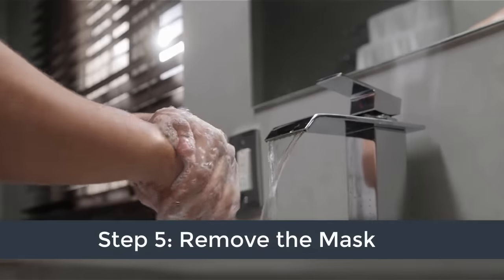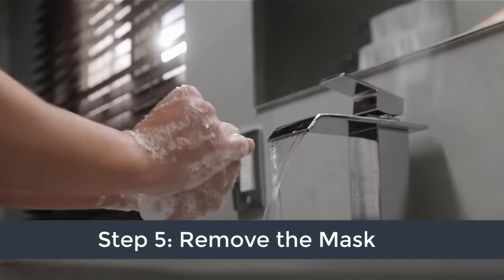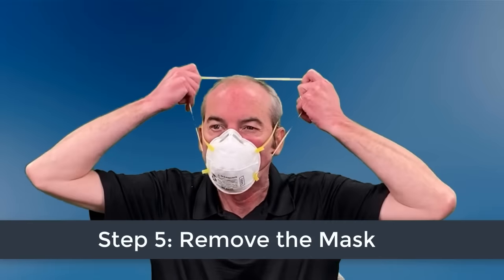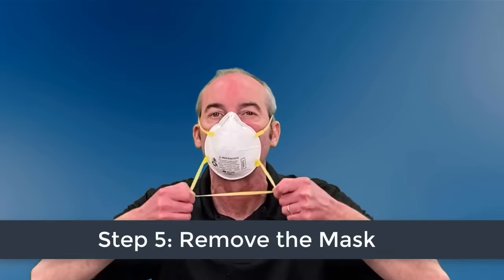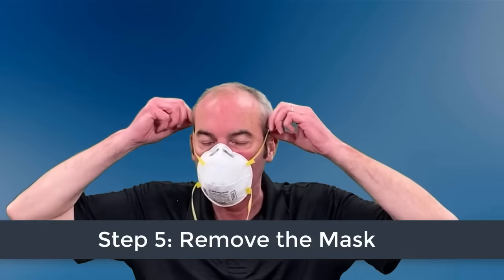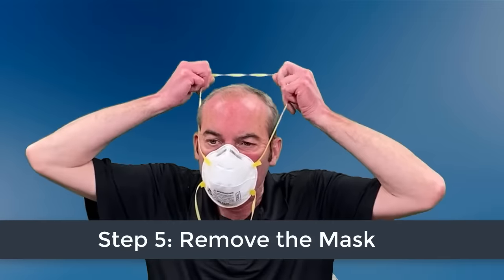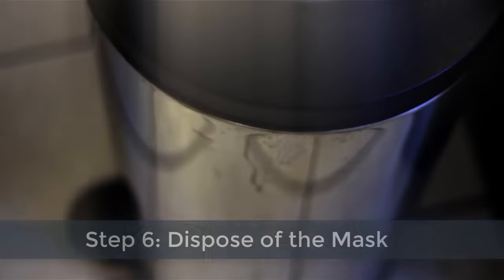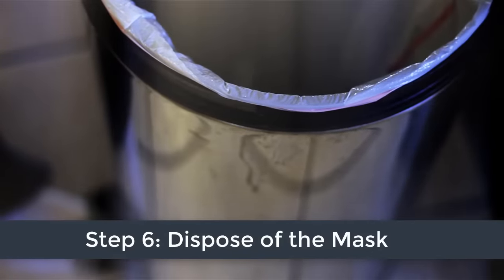Before removing the mask, first thoroughly wash your hands, then reach up and pull the strap over the back of your head without touching the respirator. If your mask has two straps, remove the bottom strap first, followed by the top strap. Discard the mask in a waste container and again thoroughly wash your hands.